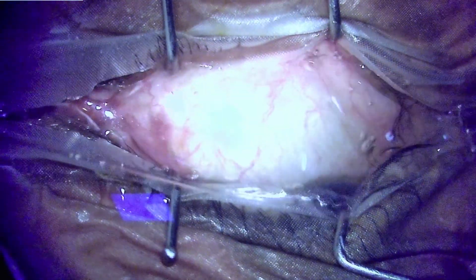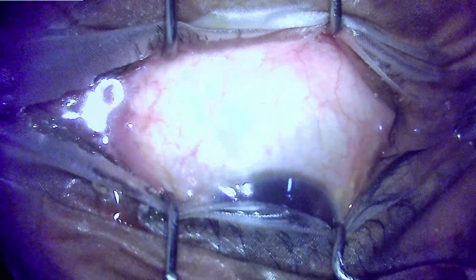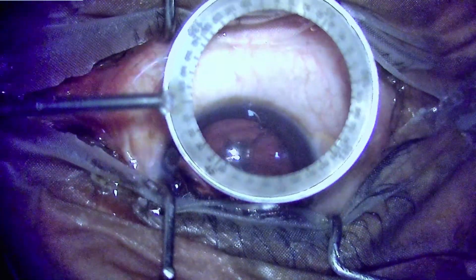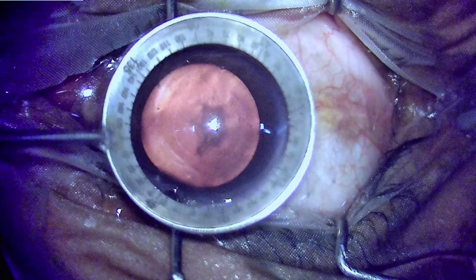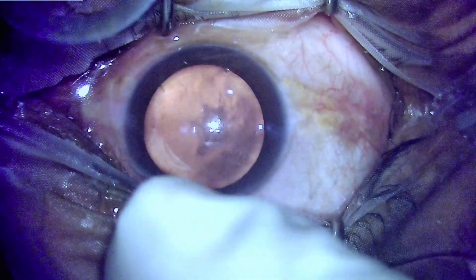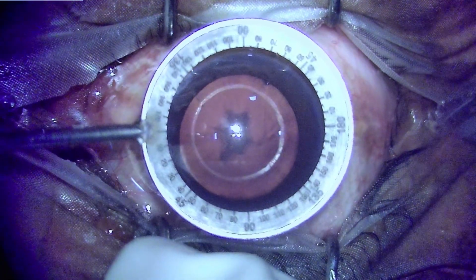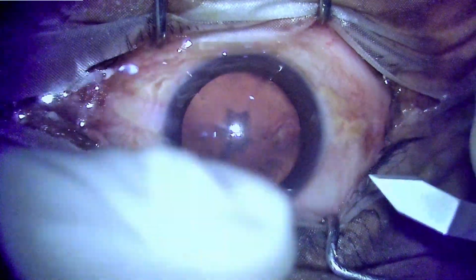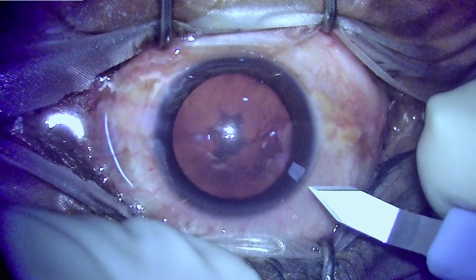Apart from that, this patient had an intense amount of photophobia and blepharospasm, which you can see the moment the corneal surface is irrigated. The patient has nearly total occlusion of the palpebral aperture. So I decided to operate this patient under very low light.